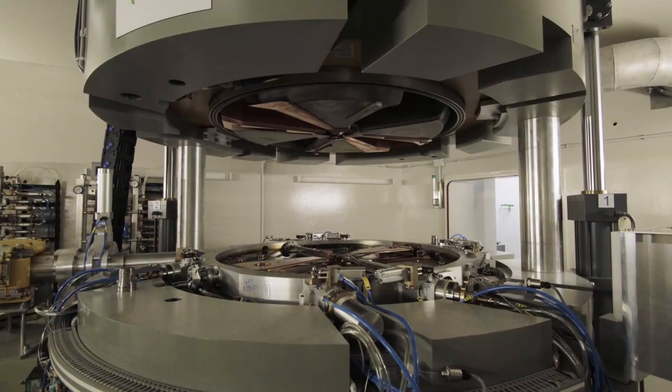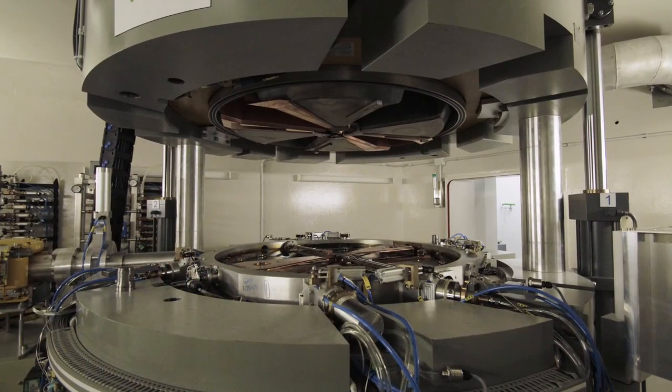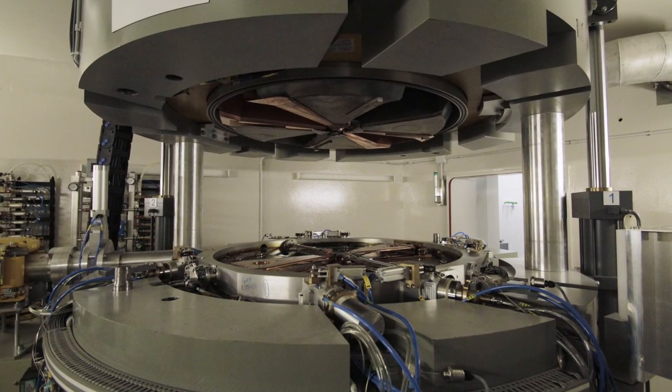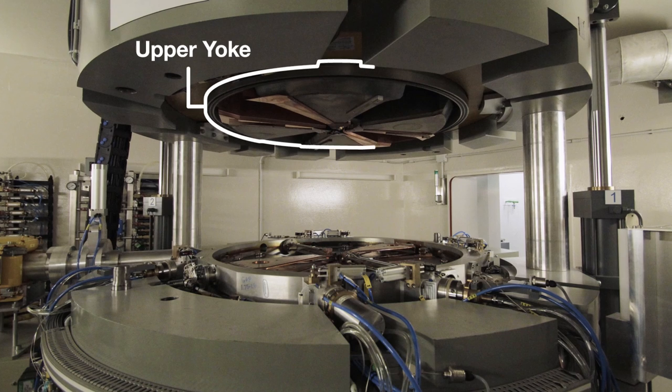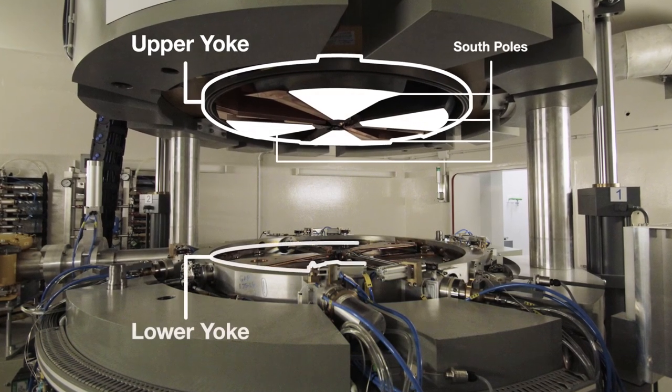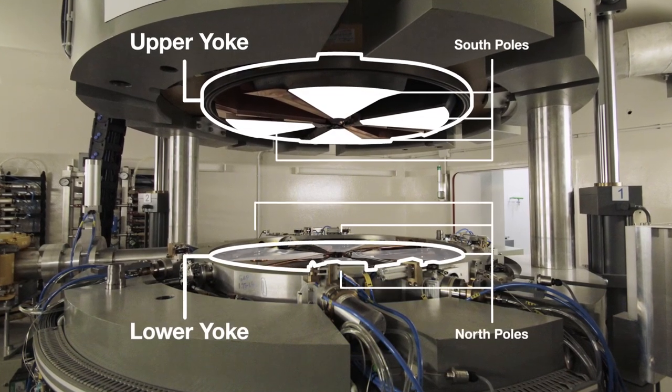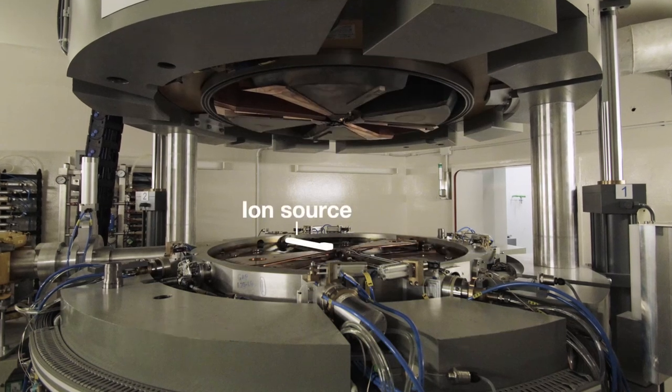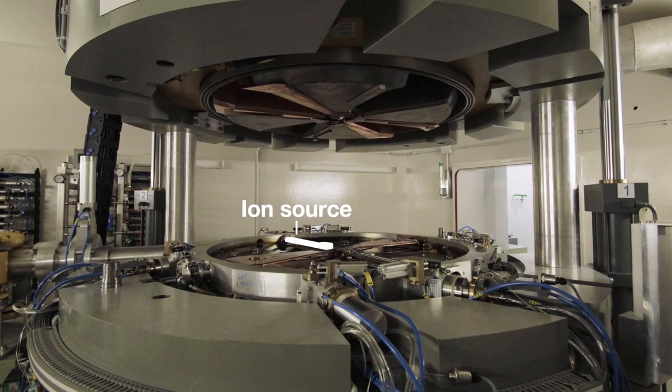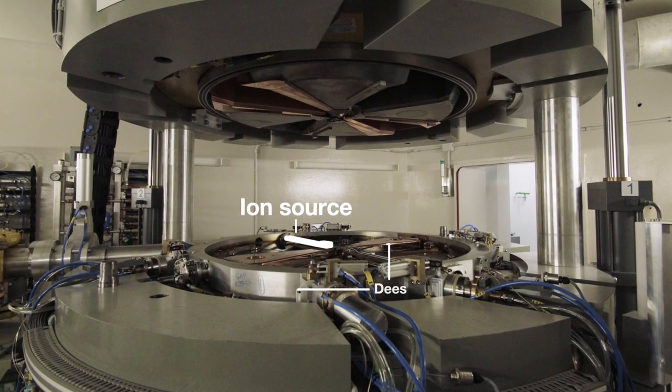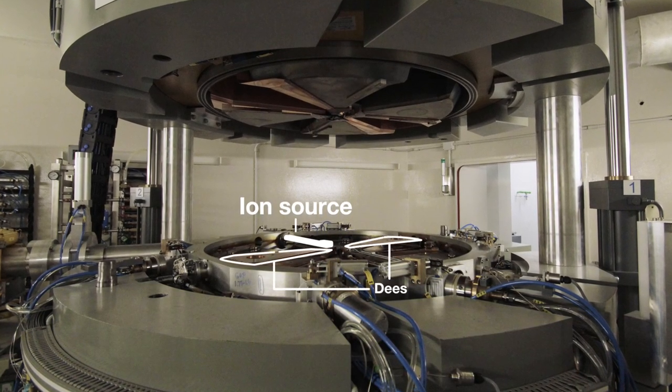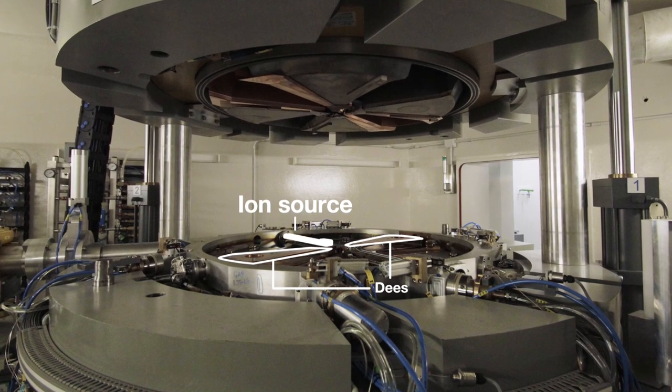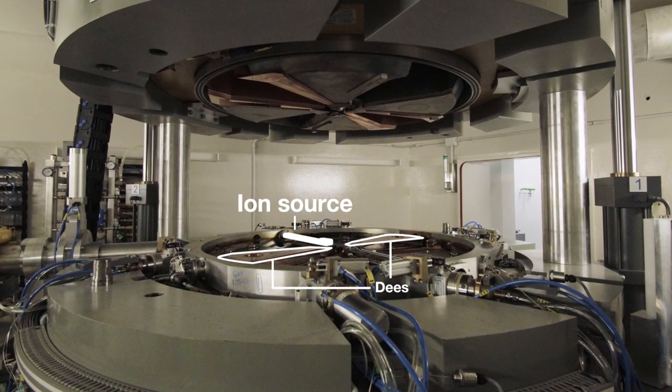If we look inside the cyclotron, we can see some of its major components. The upper yoke of the magnet with its four south poles, the lower yoke with its four north poles, the ion source used to generate and introduce the ions, and the cyclotron Ds that are used to apply the electric field to the ions for acceleration.